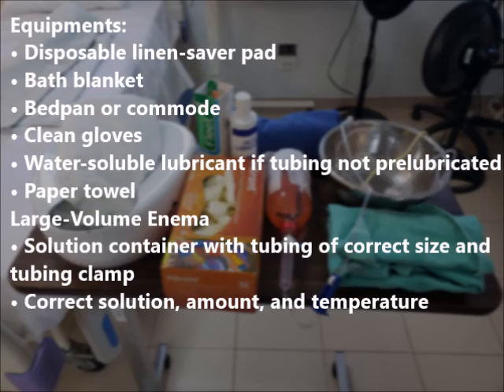Next, gather all your equipment. Identify your patient using 2 protocols and explain the procedure to your patient. Then get ready to start your procedure.